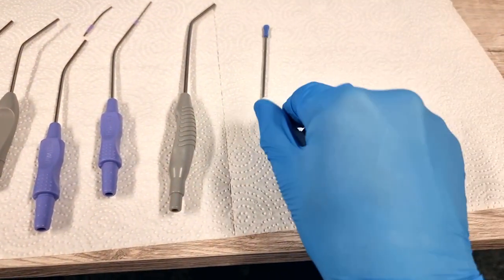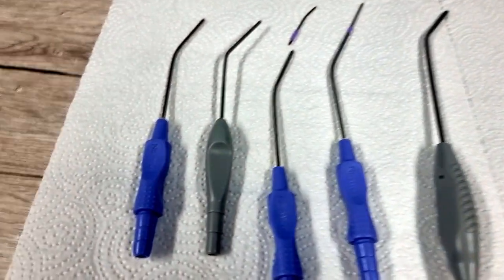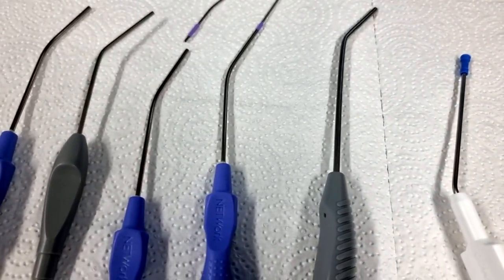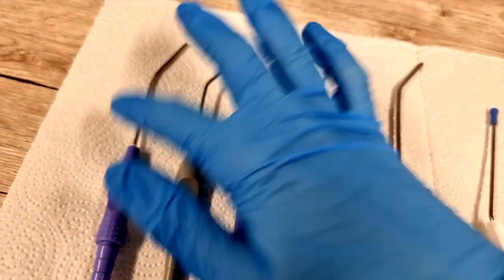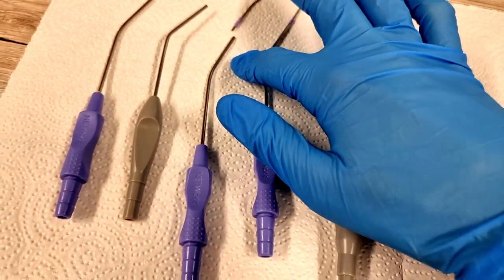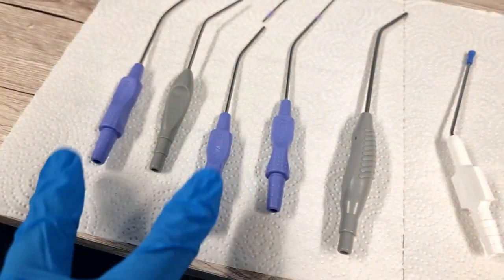So there we go. These are the suction probes that I use. There's pretty much something for everything there, for any particular case that you come across. This guy and this guy are used consistently, and you'll see those two in most videos.